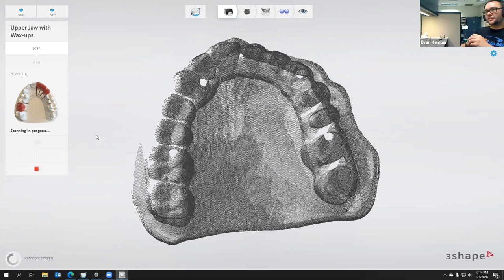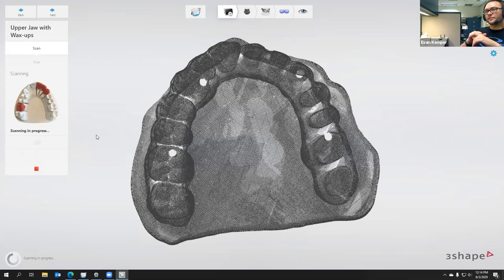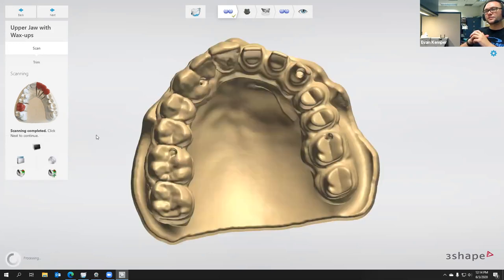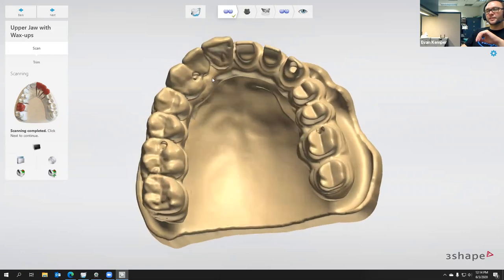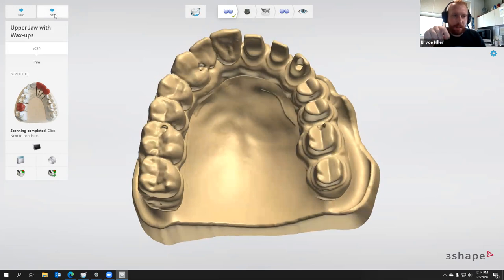Another thing to do, I'm not going to do it on this, but I would, at least in the wax-up scan, plug the screw holes on the occlusal side, just because you'll have to sculpt that in. If the software is doing non-angled screw holes, it should punch right through in those locations. But if you were going to move the screw hole somewhere else, you'd want to fill that in. Yeah, I like to use Teflon, like put a little bit of Teflon tape and then cover it with wax. If you use just wax, a lot of times it'll clog up your screw a little bit.